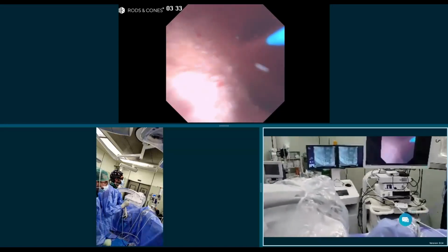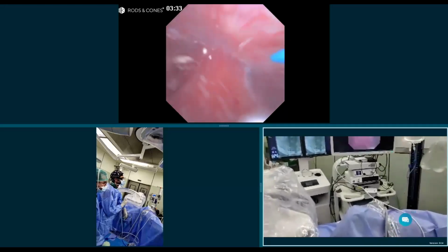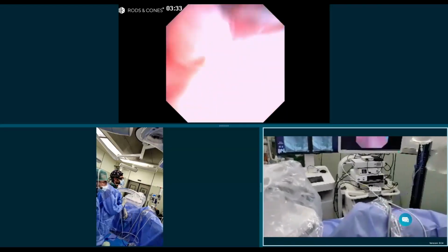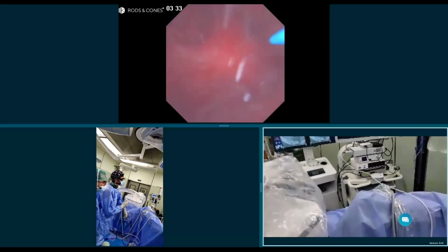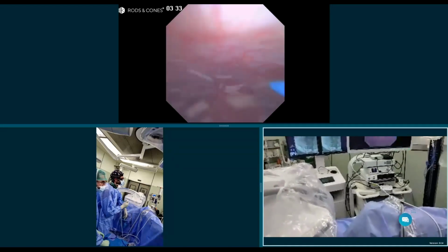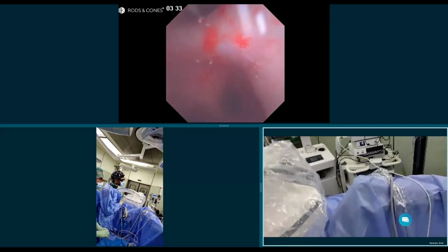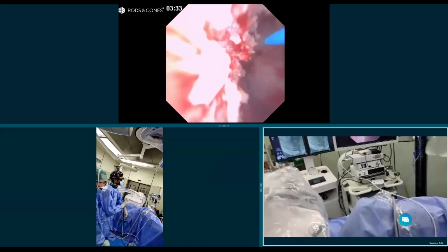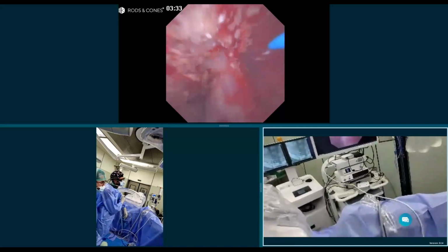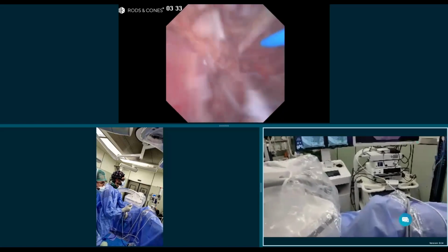So I think we have treated the stone very well. It's just dust here. I'm going to do some last evaluation. Upper pole, no fragments, just the coil. Lower pole. Mid, mid lower, just minimal debris here. Some of the debris on the lower pole.